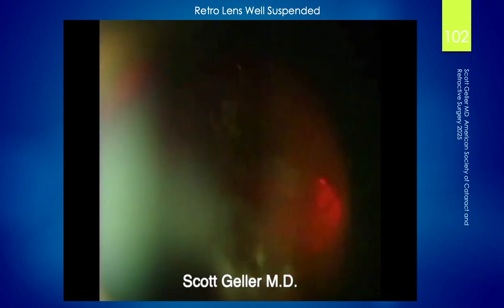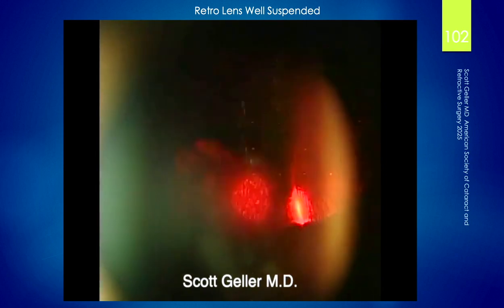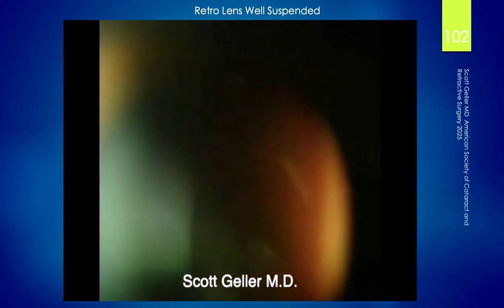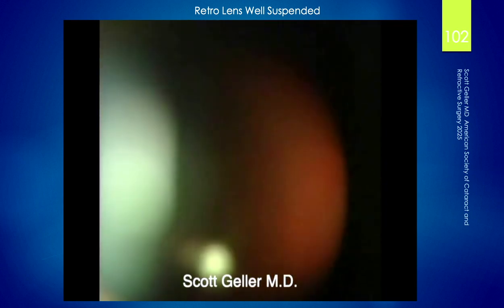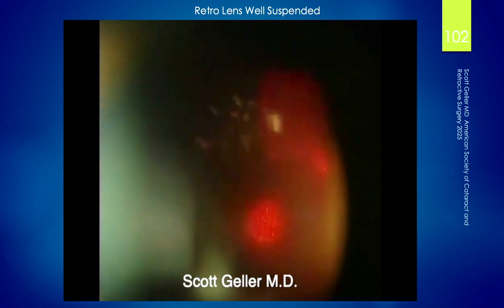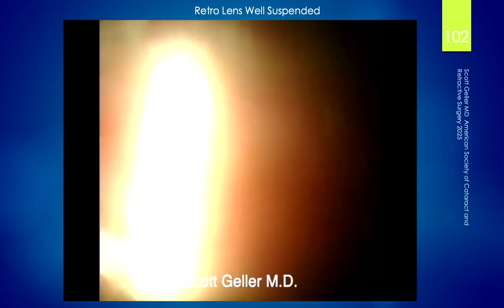When you see something like this, don't continue more than 500 pulses. You can get really wrapped up in doing this stuff and immerse your brain inside the patient's vitreous, but you don't want to get too much in there. See how they respond intraocular pressure-wise. So, there we go.